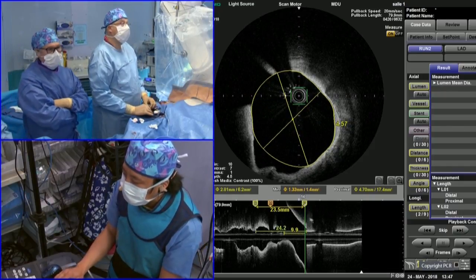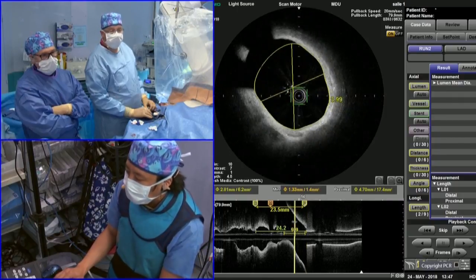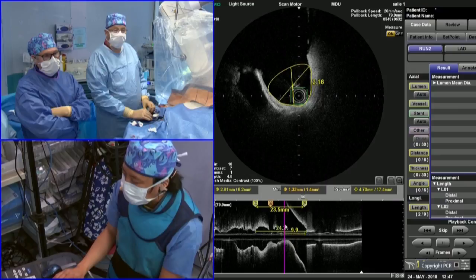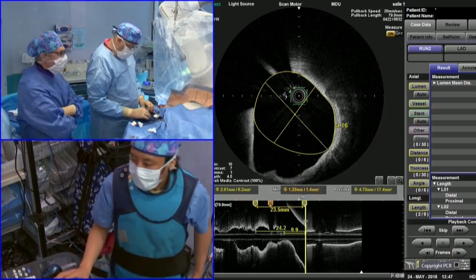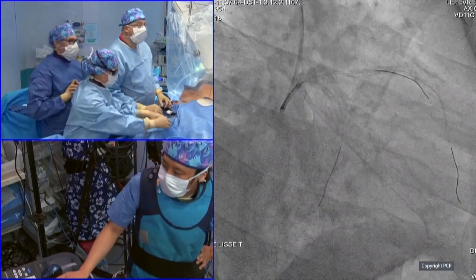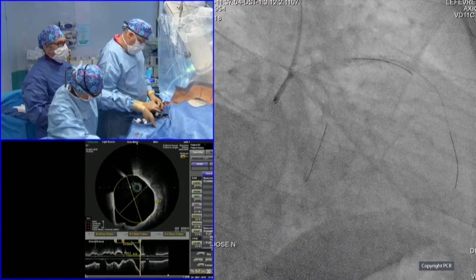And if you measure the distance from the proximal edge of the old stent to the ostium of the left main, it is 24 millimeter. And if you put a 24 millimeter stent, you still have room for the POT, because the distance from the carina of the left main to the ostium of the left main is approximately 10 millimeter. Thank you very much, Yoshi. So as you saw, the reference diameter of the left main is at least 4.5, maybe close to 5. The circ is about 3.5, and we estimate that the proximal LAD is about 3.5.